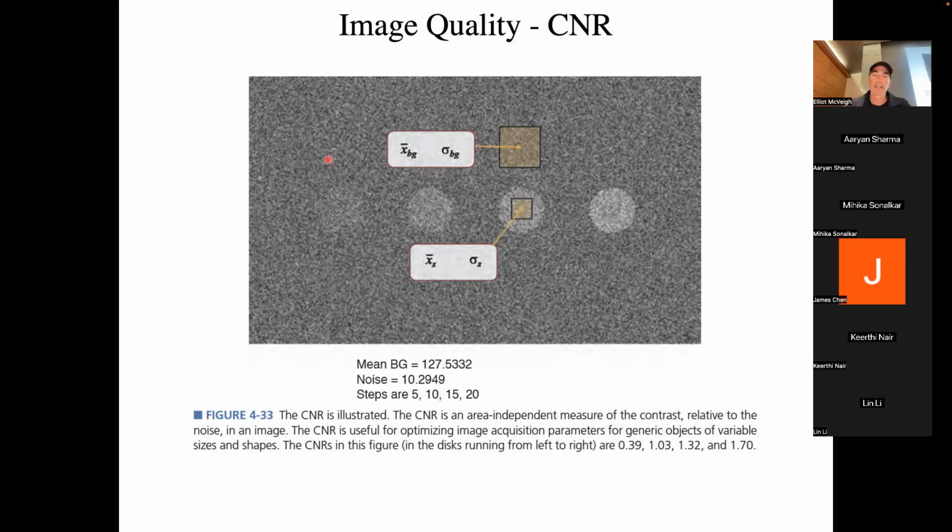And let me put on the laser here, inside this region of interest. And you take the mean value over all those measurements, and you look at the standard deviation or the variance around that mean in that field. And that gives you an idea of the signal to noise. It's just the ratio of the signal divided by the noise, right?